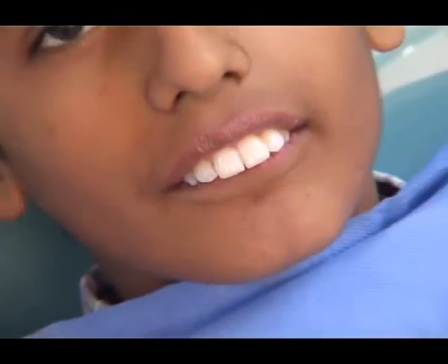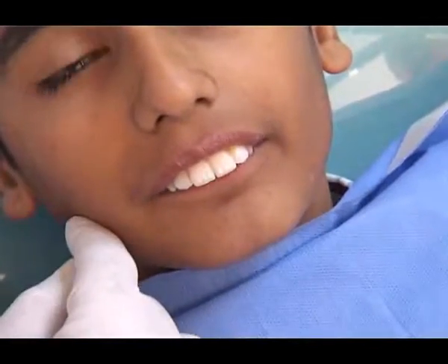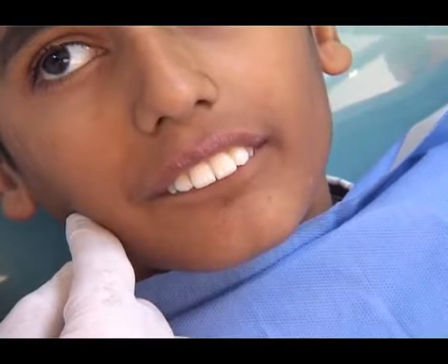This child is already trained to bring the lower jaw forward. What he needs to do is understand that we will put some wax on his lower teeth and he will be asked to bite there.